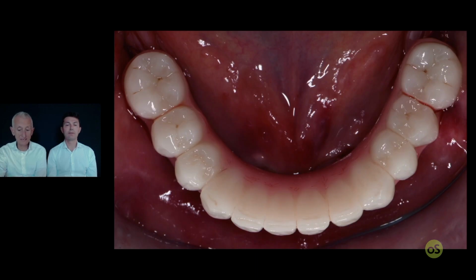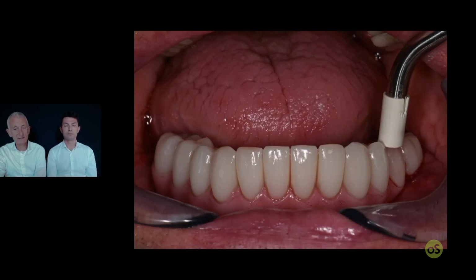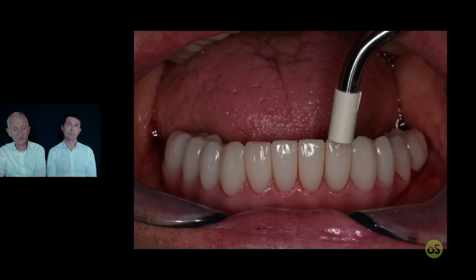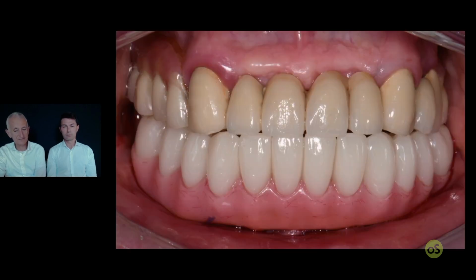Put in the mouth and engage by axial tapping on the abutment with the fixation tool. Now this prosthesis becomes a fixed restoration, cannot be removed by the patient, only by the dentist whenever this becomes necessary.